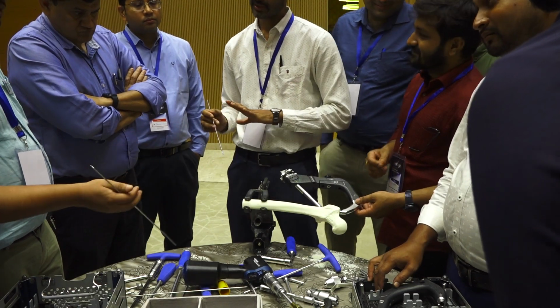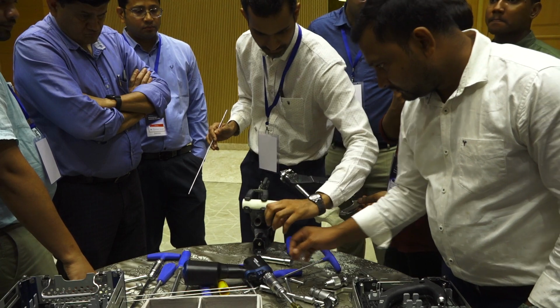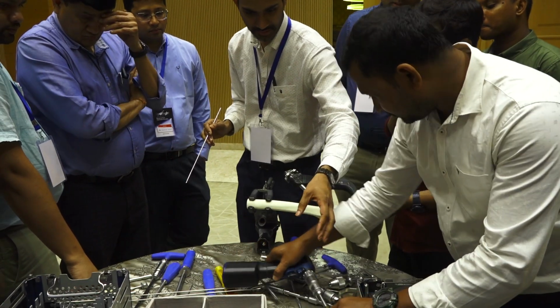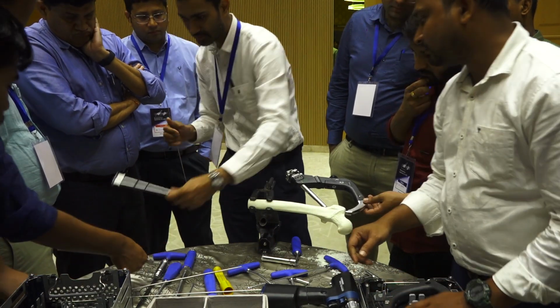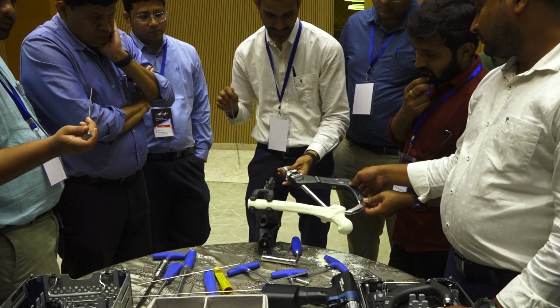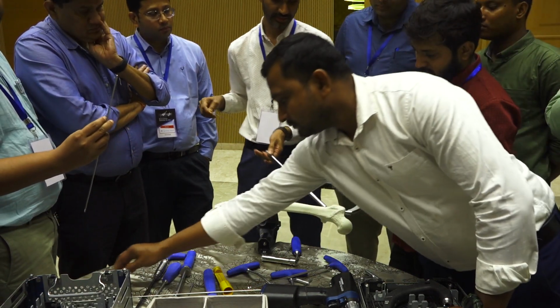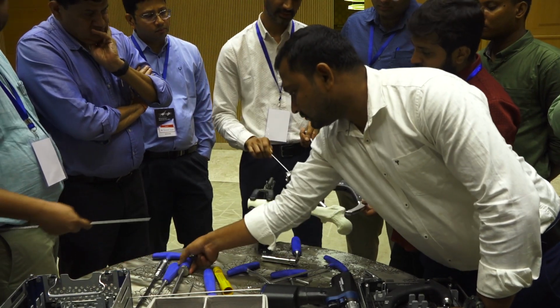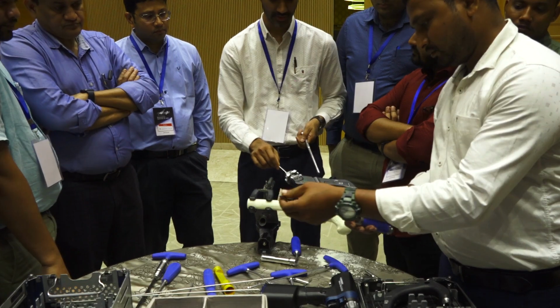So if the guide pin inadvertently comes out, it is always better to put this sleeve. See that you got this inner sleeve there. You put all these inner sleeves, and then put the guide pin, so that it will be in perfect position. Or else if you put it like this, it may fall anteriorly or posteriorly, most of the time posteriorly.